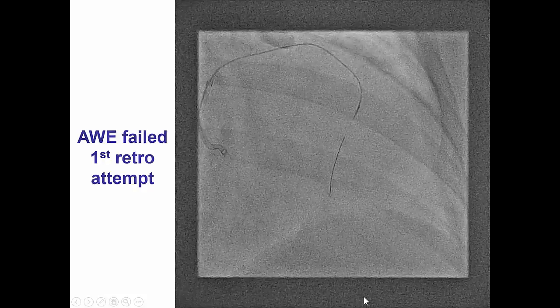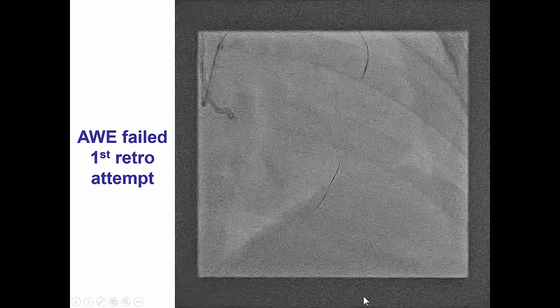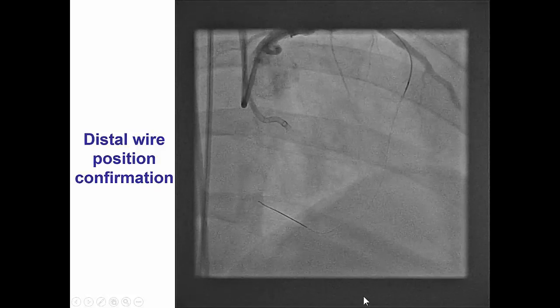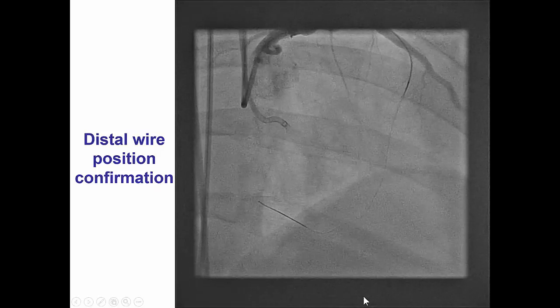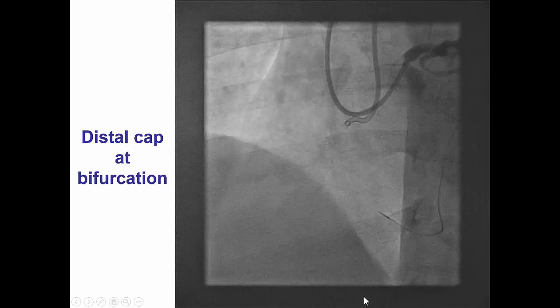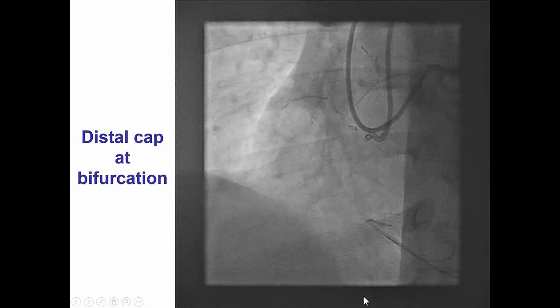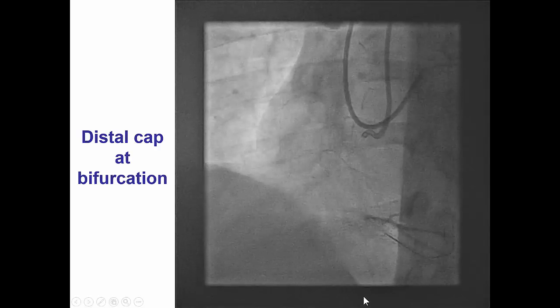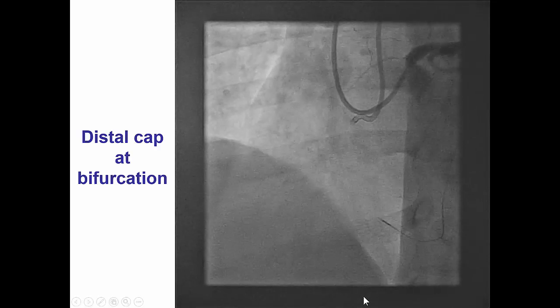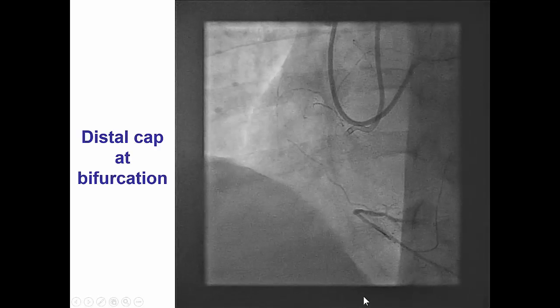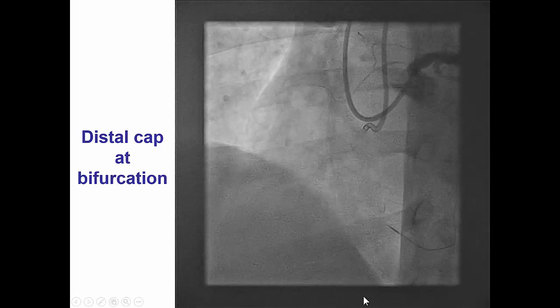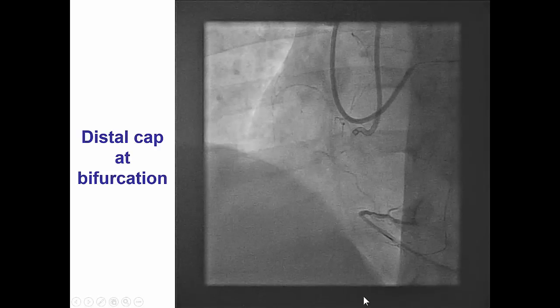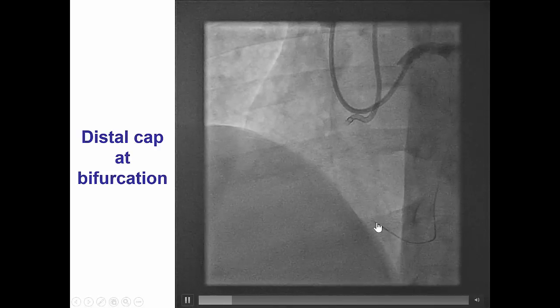We had easy crossing through a septal using the surfing technique into the posterior descending artery. This was confirmed with injection from the left main, and then we were able to advance a Corsair microcatheter all the way to the distal cap. By doing an injection we can see that the bifurcation of the distal cap is pretty hard to recanalize.